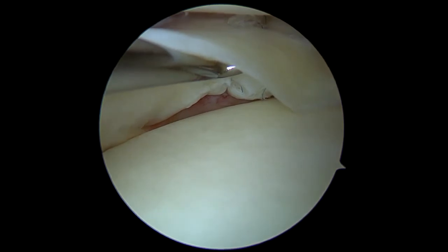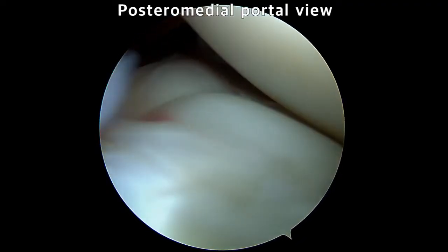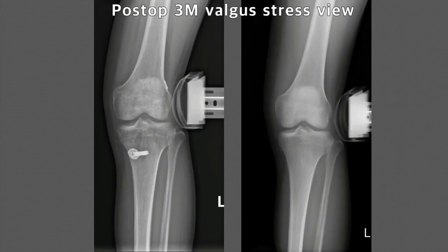To show the repaired state, the arthroscope is advanced through the posteromedial portal, and the well-reduced ramp lesion is confirmed. After that, ACL reconstruction was performed.